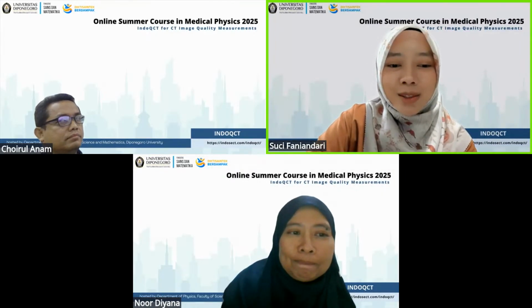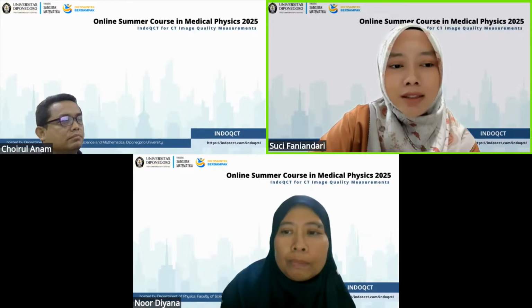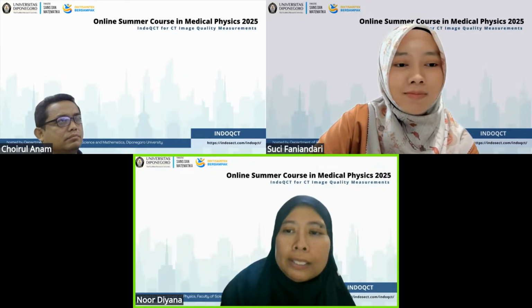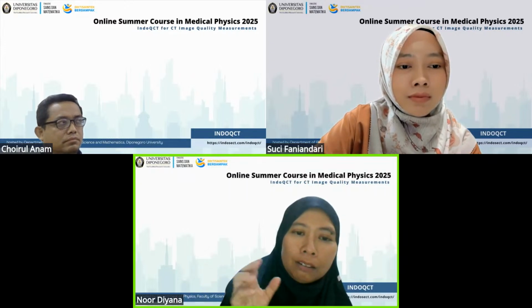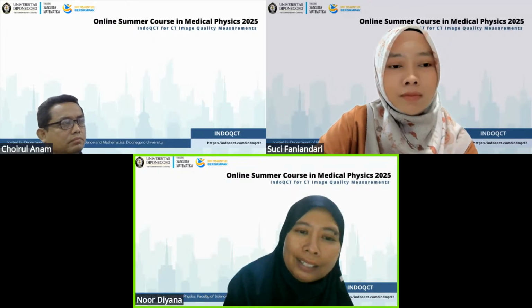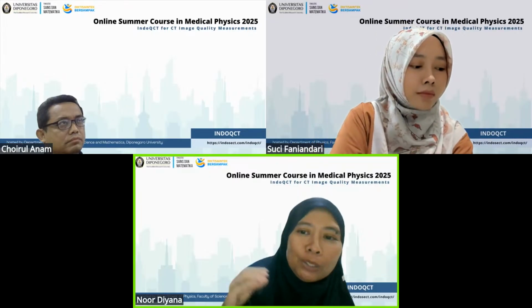Okay, thank you for the answer, Dr. Nurdiana. And then the second question is from Muhammad Yasin. What is the reason that screen film system has higher spatial resolution compared to CT? Okay, to answer this question, screen film depends on the properties of the films, because in conventional films, it has silver halide crystals, which are much smaller compared to CT.